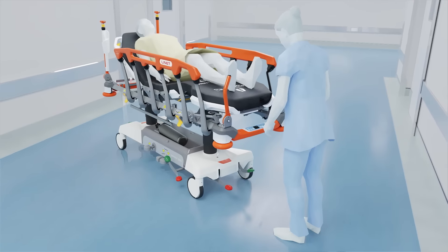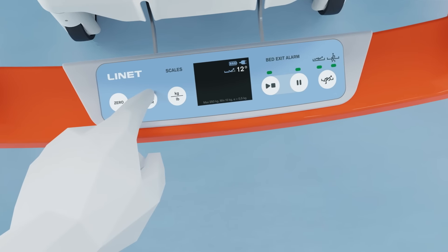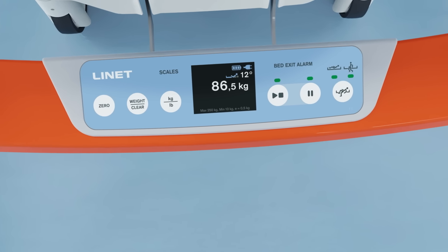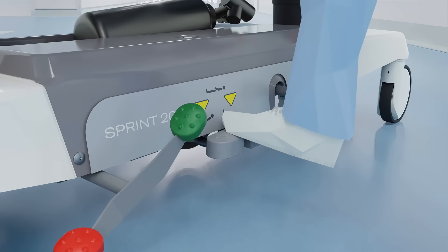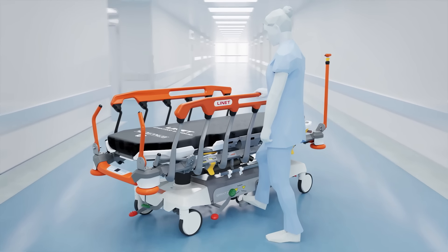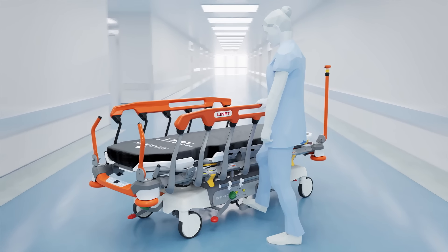Scales with market-leading precision of 0.5 kilograms help caregivers to make more accurate decisions without moving the patient. The hydraulic foot controls are intuitive and accessible to position the stretcher even in the most challenging circumstances.